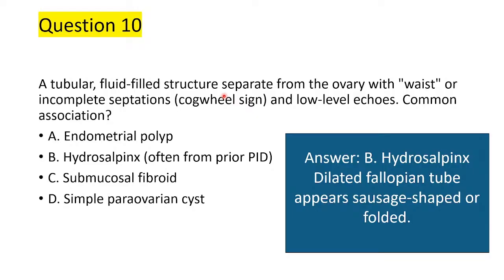At the same time, you must also appreciate the role of patient history whenever you are doing an examination. For you to confirm that somebody has an ectopic pregnancy, especially if it's too small or non-viable, you must have an understanding of the pregnancy test result.